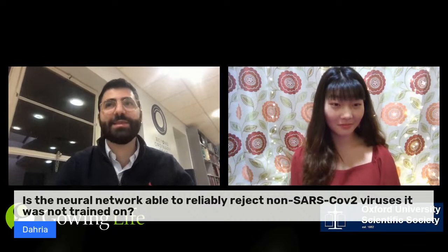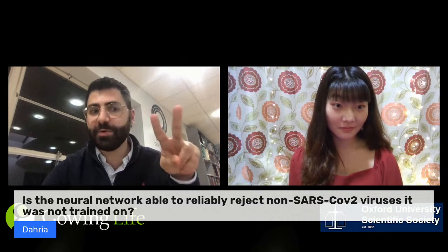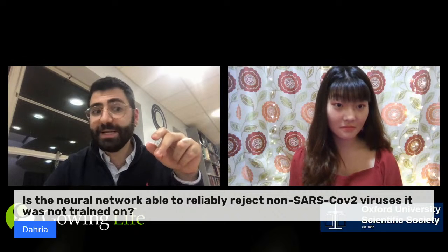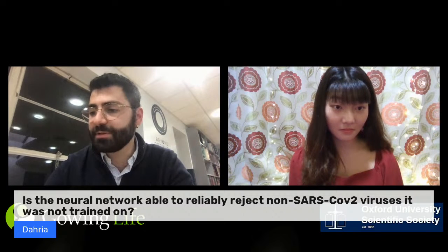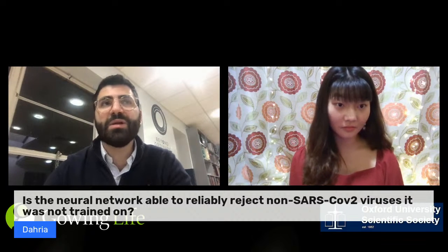So essentially what you do with supervised learning, you give it two options and you tell it it has to be one of these two options. So it's really hard to predict what it would be. There are methods that can be deployed to make sure it doesn't confuse it for other viruses. But just to be safe, there is only a limited amount of pathogens, and in this case, viruses that are circulating in the population, and that's the seasonal flu, the seasonal coronaviruses, and in this case, the SARS-CoV-2. And as we've shown from the results, it is really easy to distinguish between these three broad categories. So there is no reason not to train the network on everything, if that makes sense. I wouldn't risk it.